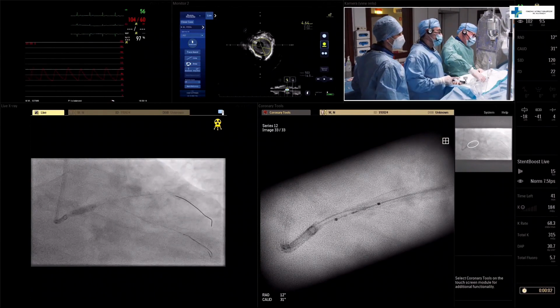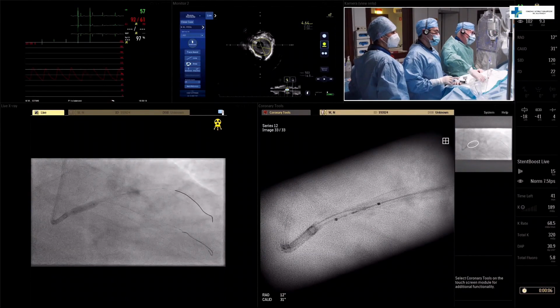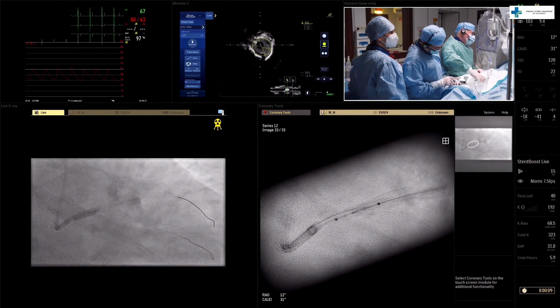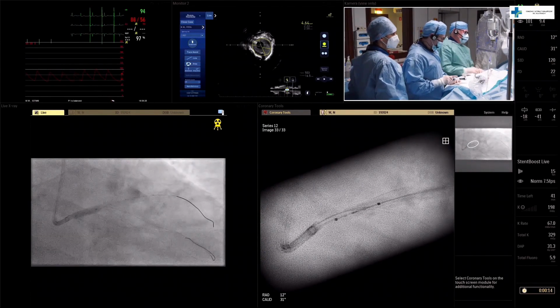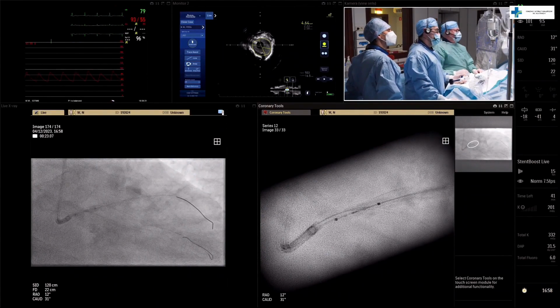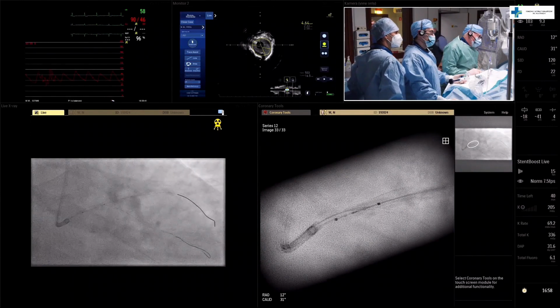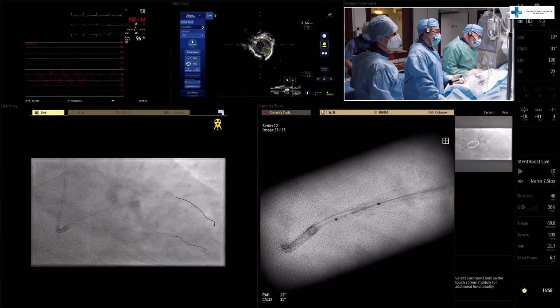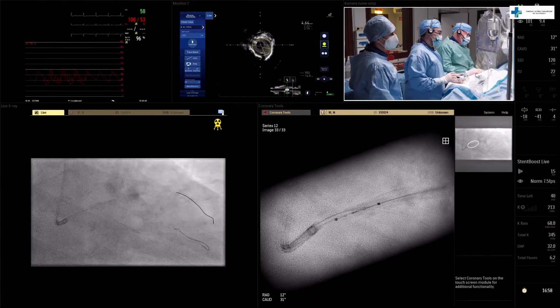Okay, went back, so we will do here first. Of course, all the time we will see the pressure, and this is the problem with the left main, that we can have some hemodynamic compromise, but you see that it is possible. So we did first 10 pulses in the left main with some jump towards the LAD. So now I will try to go a little bit more distal. And Pavel, if possible, try to do it again here.